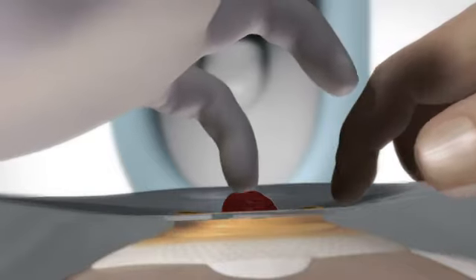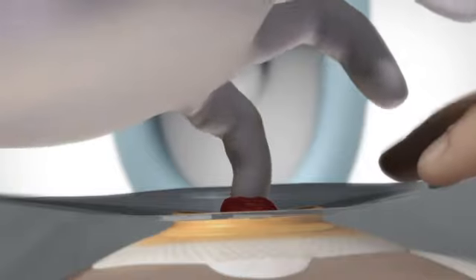Now gently put your finger into the stoma to feel in which direction the cone should be inserted in order to follow the intestine. You might choose to wear a glove for this purpose.